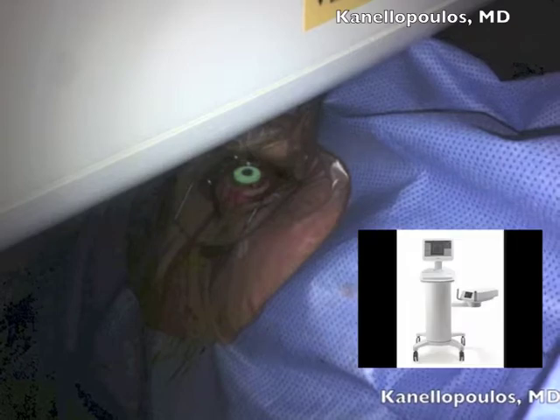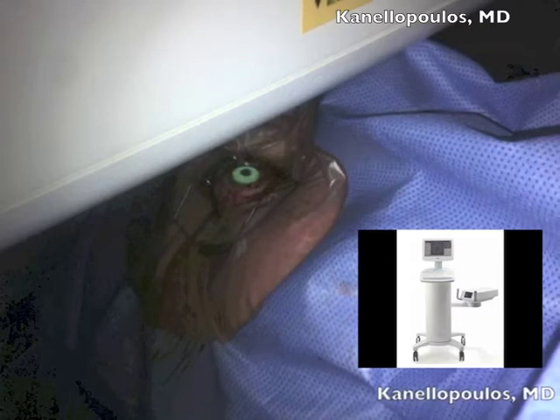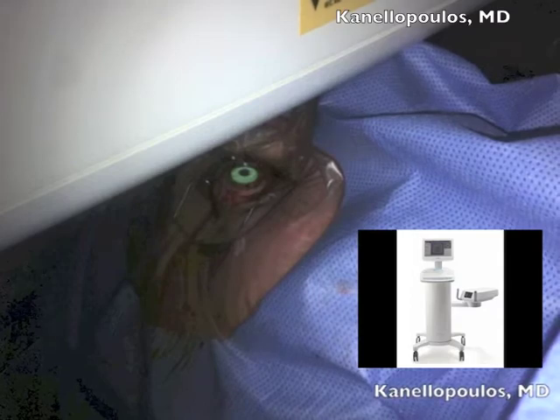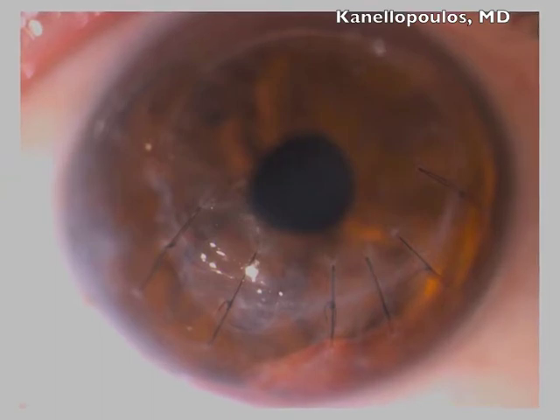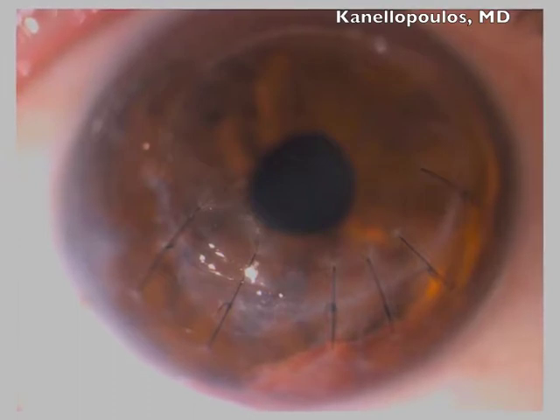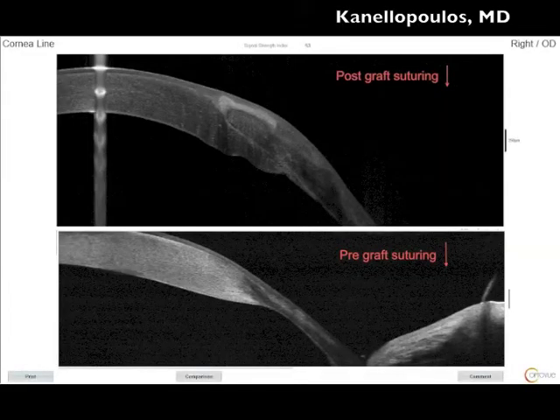We'll see an image here — you can see how nicely the hyperfluorescent ring of the UV light on the cornea, only in the perimeter of the graft-host interface. Obviously, suturing alone will give great results, and we can see here a slit lamp photo several months later. Obviously the sutures are still tight, and you can also see the slight haziness in both the graft and the host which was achieved from the cross-linking process, and the tissue there is — in lack of a better term — bunched up.